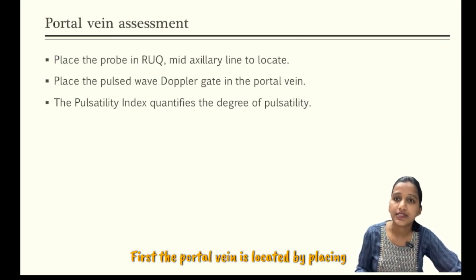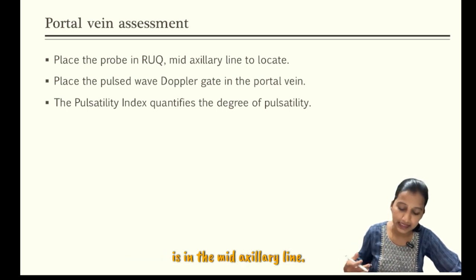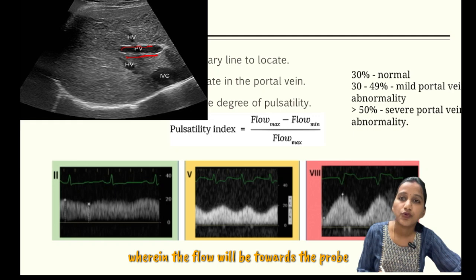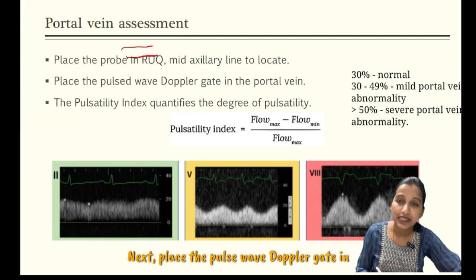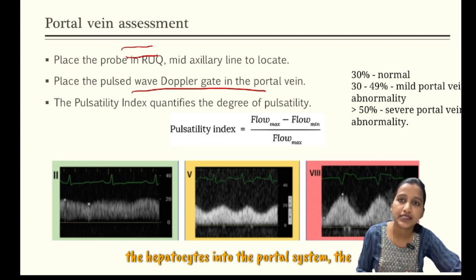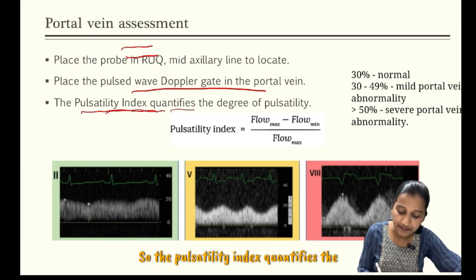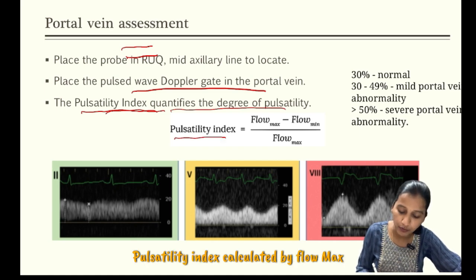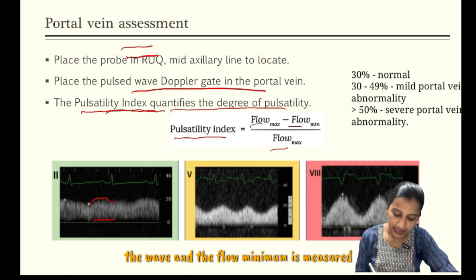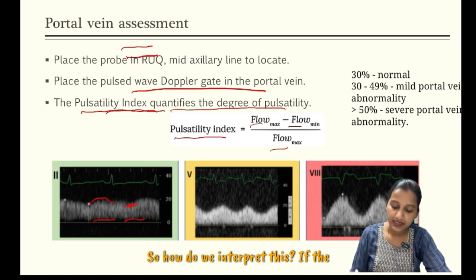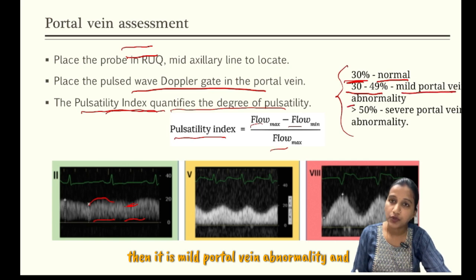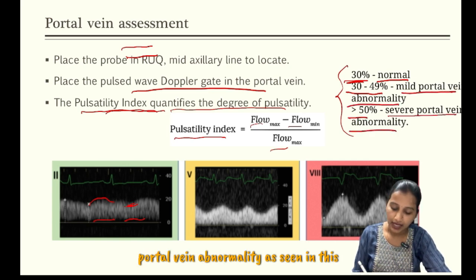Next, coming to portal vein assessment — the portal vein is located by placing the probe in the right upper quadrant in the mid-axillary line. The portal veins are best identified by the presence of thick and hyperechoic walls. Confirm with color Doppler wherein the flow will be towards the probe and the vein will be seen as red color. Then place the pulse wave Doppler gate in the portal vein. As venous congestion increases and pressure from the hepatic vein is transmitted across the hepatocytes into the portal system, the flow becomes pulsatile. The pulsatility index quantifies the degree of pulsatility and is calculated as: flow max minus flow minimum, divided by flow max. If the pulsatility index is less than 30%, it is normal; between 30 to 49% it is mild portal vein abnormality; and if more than 50% it is severe portal vein abnormality.